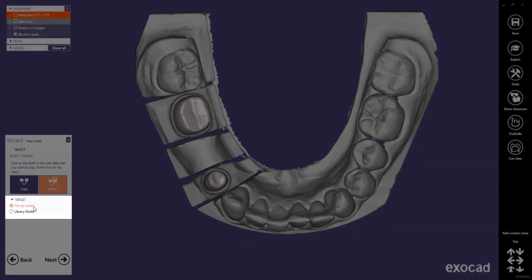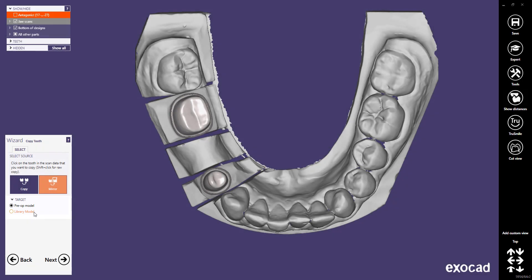Furthermore, you can decide if the copied or mirrored teeth behave like a pre-op scan model — virtual pre-op — or like a real library tooth — direct copy.